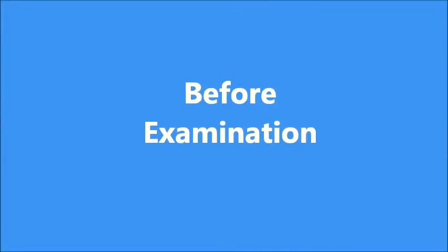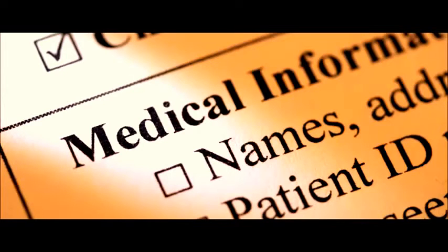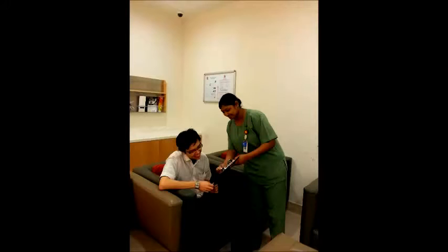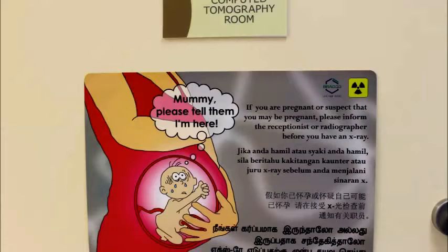Before the examination, we need to check your name, date of birth, patient ID, confirm it is the correct site and procedure to be carried out. For female patients, we need to know your first day of your last menstrual period to confirm you are not pregnant. If you are pregnant, please let us know.